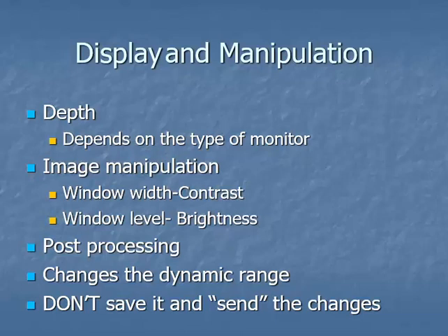So what you're going to have to do is look at your image for these telltale indicators that we were talking about before. Is your S number right? Is your collimation right? Is your positioning right? Did you do everything properly? Is your technique representative of what that patient should have been exposed to? And if your image still doesn't look right, that doesn't mean it's not going to look right on the radiologist's monitor.